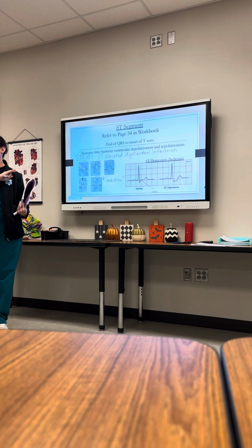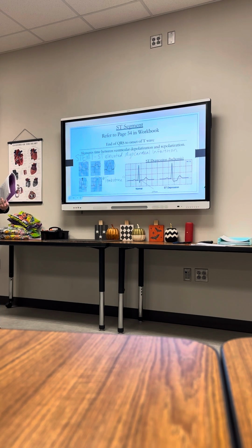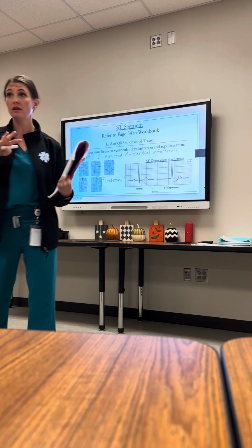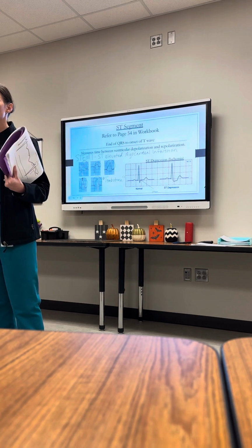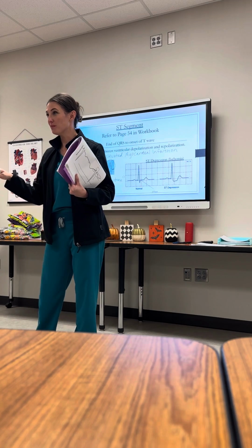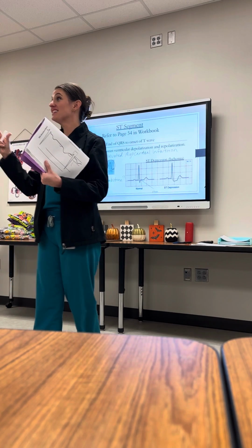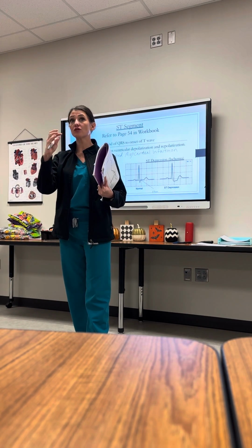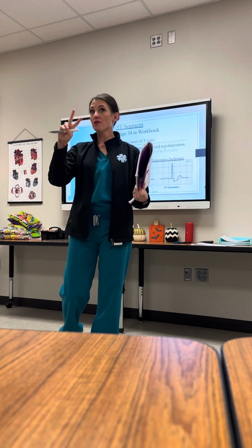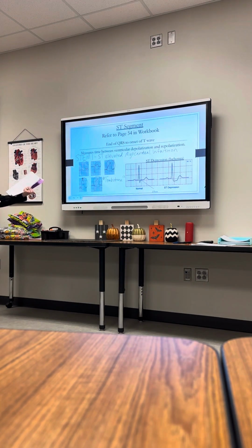So here's something to think about though. If I see ST elevation in one of my leads, what do I need to do as a technician? Remember how we talked about if we see something abnormal in one lead, what should we do? Check the other leads that are, what's that word? I want you to remember, it starts with a C. Contiguous. I need to take a look at my contiguous leads. So I'm going to look in those leads that are looking at the same area of the heart. And if I see abnormality in 2 or more, then we're looking at a concern, right?